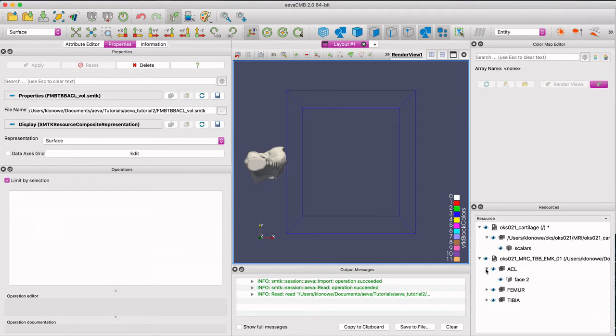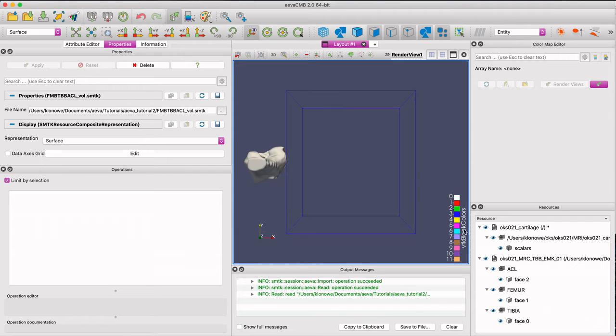You can see that the files open as two resources: one that contains geometry and the other that contains volume.